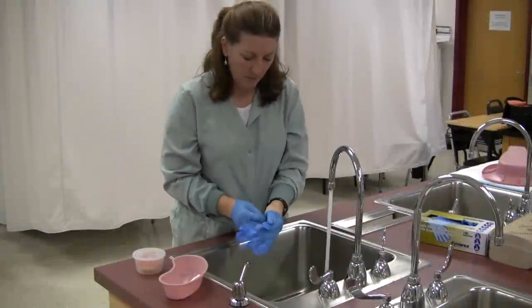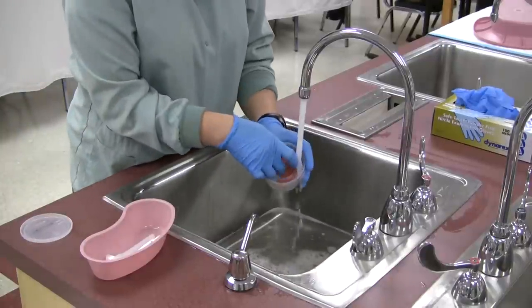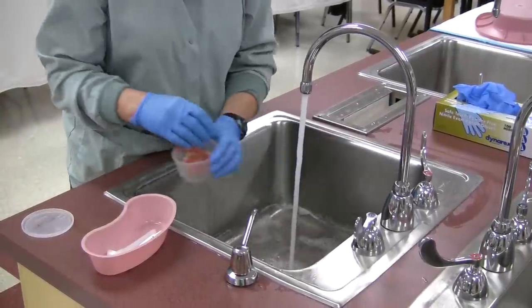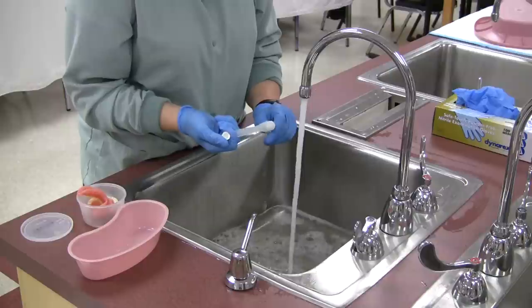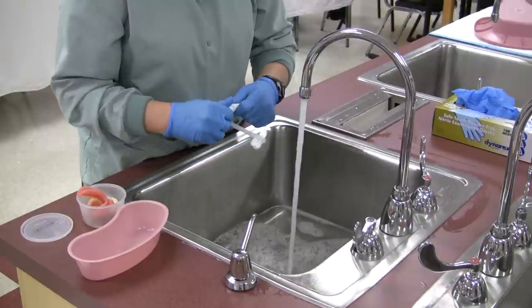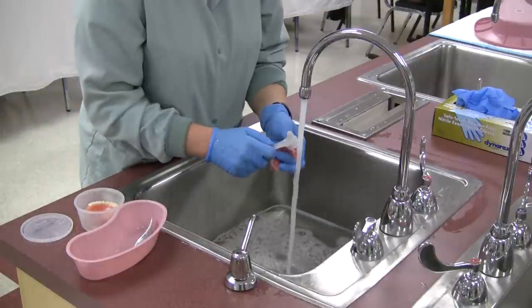Put on gloves before handling the dentures. Line or partially fill the sink with water. Rinse the dentures in moderate temperature running water before brushing them. Apply toothpaste to the toothbrush and brush the surface of the denture.